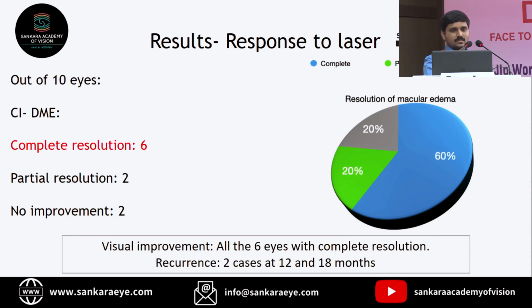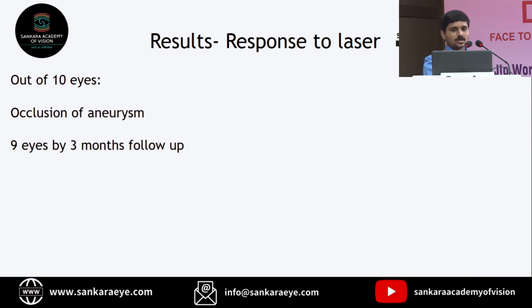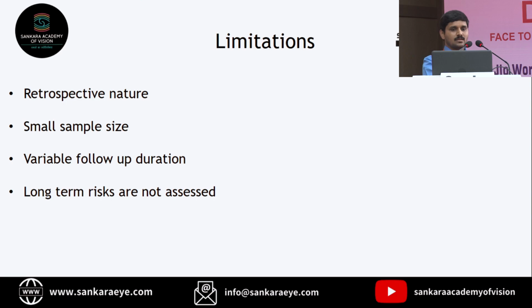So out of the 10 eyes, we could see a complete and long-lasting resolution of macular edema in 6 cases, a partial resolution in 2 cases, and no improvement in 2 cases. The aneurysm could be completely obliterated in 9 eyes. So the limitations of the study are its retrospective design, small sample size, variable follow-up duration, and long-term risks are not assessed.